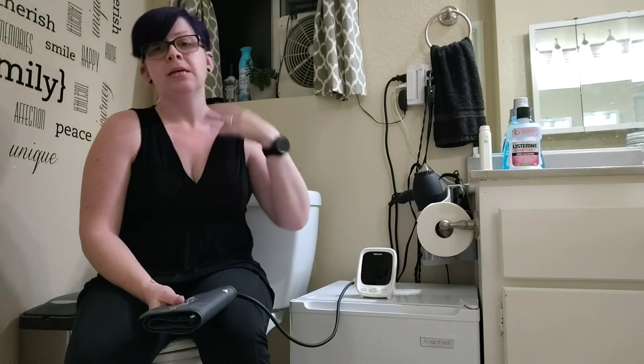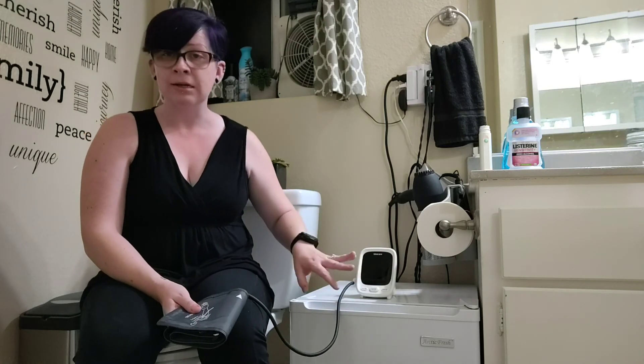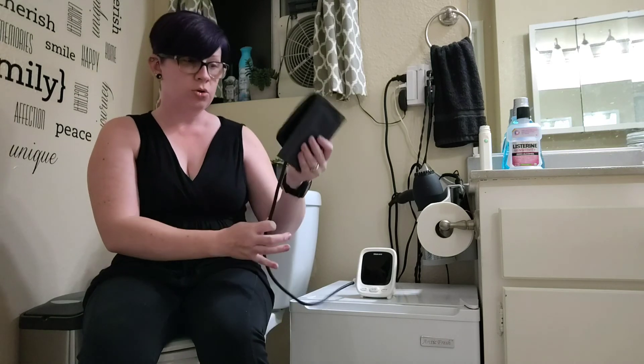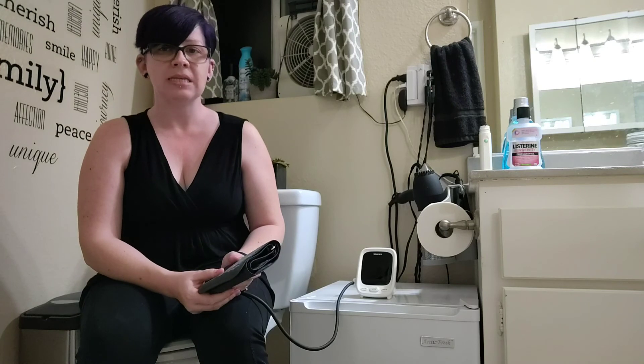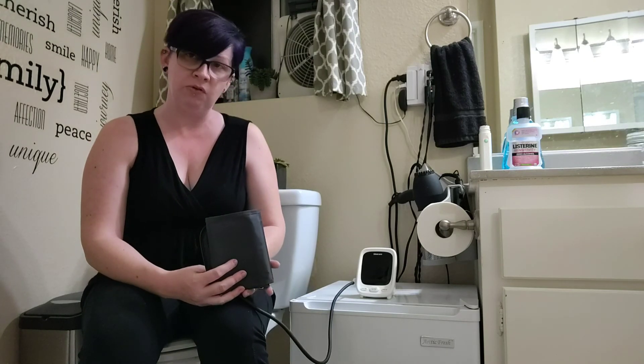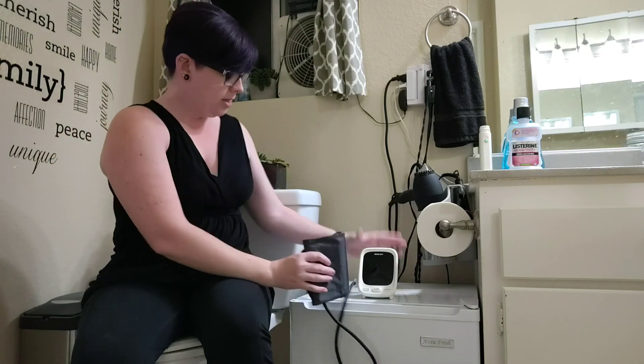It's going to walk you through it, tell you your readings out loud as well as on the monitor, give you the indicator light so you know if it's a normal or high reading, and remind you where to put the tubing and how to face it for the artery. This is a very basic, layman-friendly blood pressure cuff — if you're not overly comfortable with medical devices, it keeps things nice and simple. So there you go, I hope that helps.